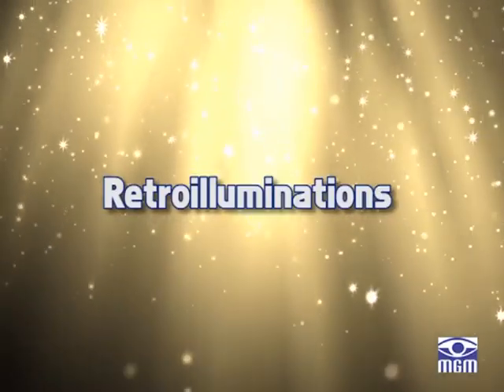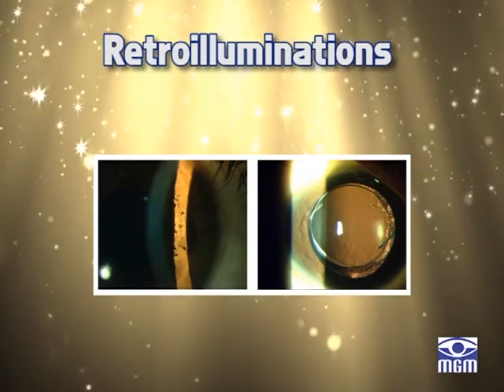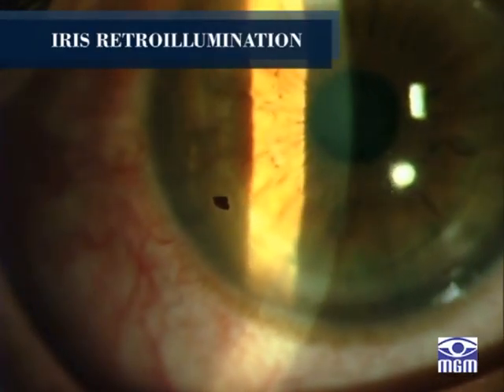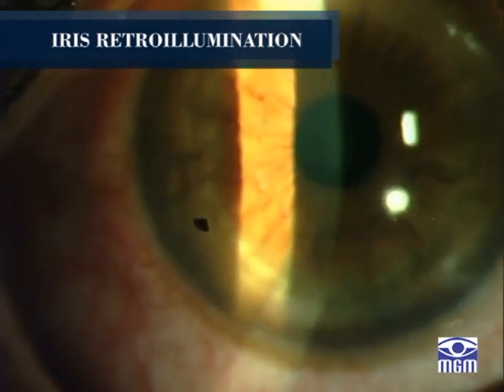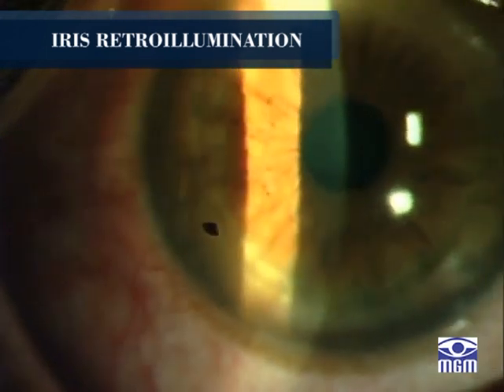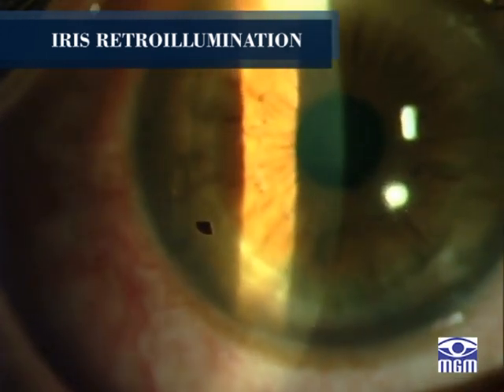In retroillumination, the light strikes the object of interest from a point behind the object and is then reflected back to the observer. In retroillumination from the iris, the observer is at right angle to the observed structure and not in line with light. So the pathology is seen against a dark, non-illuminated background.